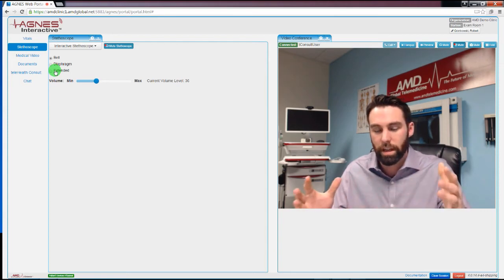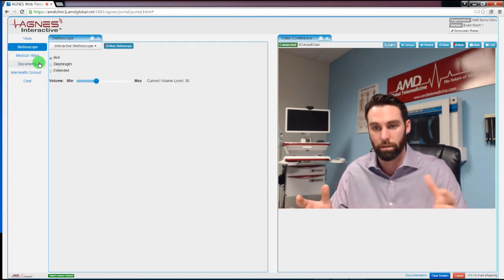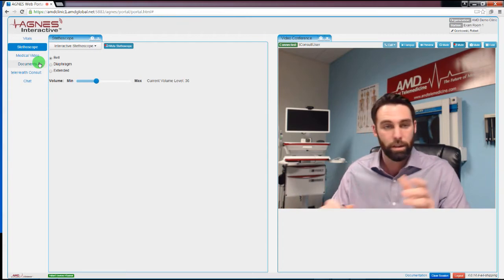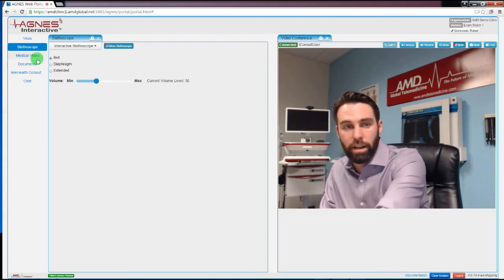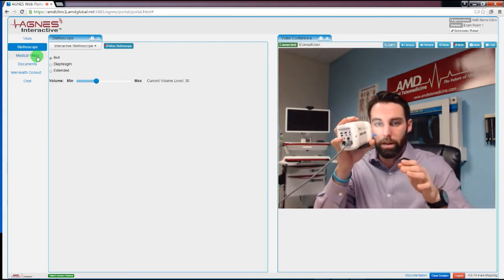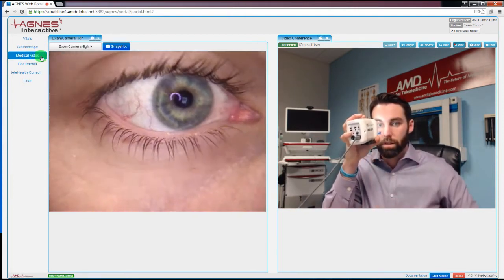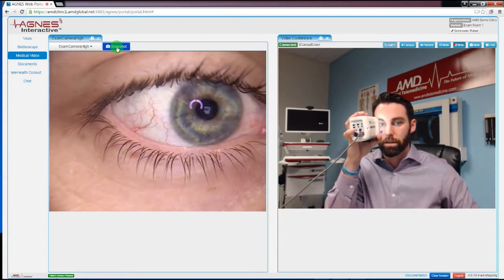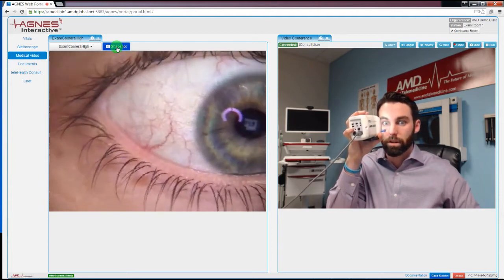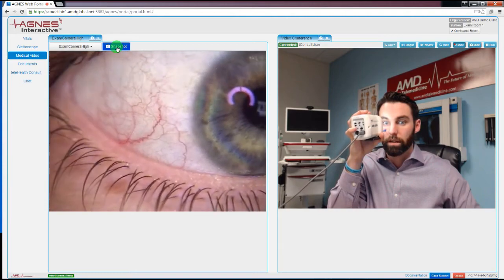Also, within a telemedicine clinical encounter, you should have the ability to take a closer view of the patient using other diagnostic tools, such as a general examination camera. If the patient comes into the clinic complaining of discomfort in their eye or a rash, the nurse, at the direction of the doctor, can give the doctor a really close-up, high-quality view of the eye.